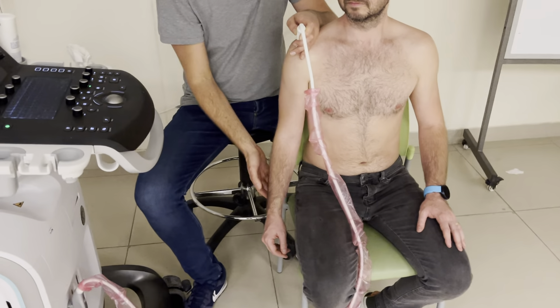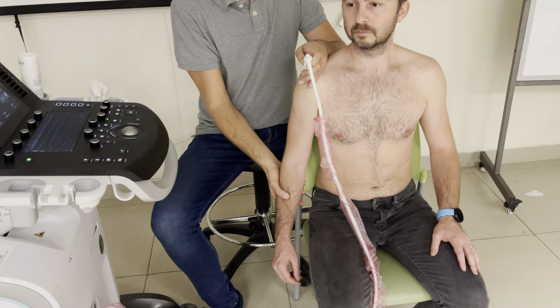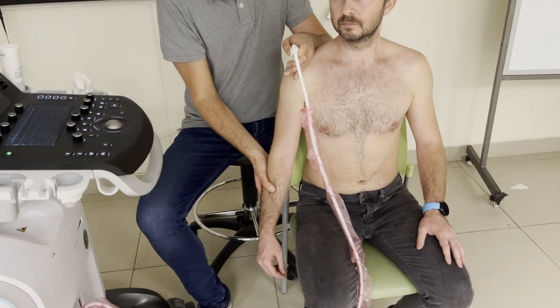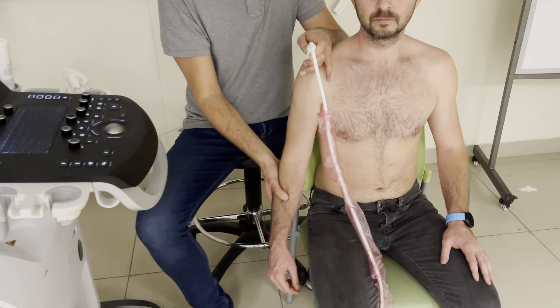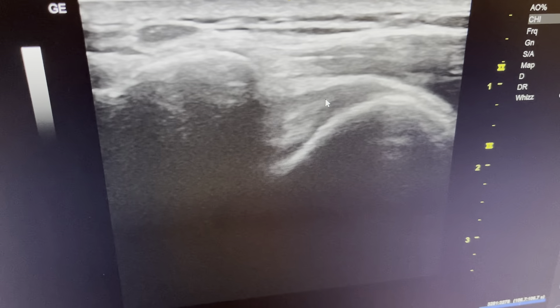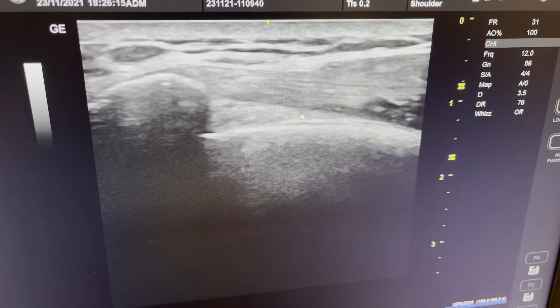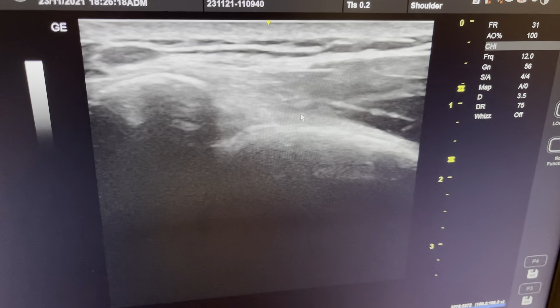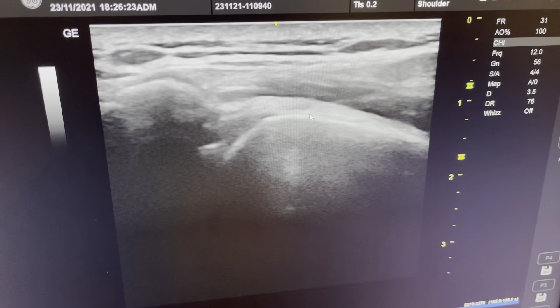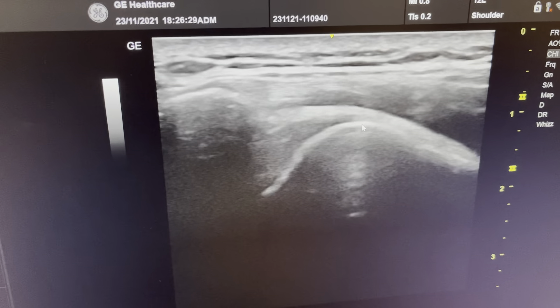It's easiest to do the movement yourself — don't ask the patient, because they're going to go every way except the way you want them to go. So I make this passive movement in this direction. Here we have the neutral position. Now I'm going into abduction — we see the last bit of tendon going under, now the greater tuberosity is going under. And we go back. We see the bursa, and we see that it creates a nice sliding for the tendon to go under the acromion.